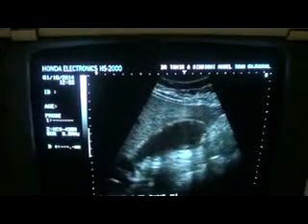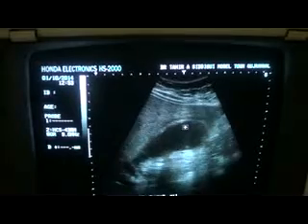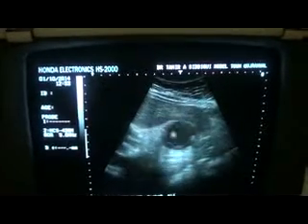This shows the anterior and posterior wall of the gallbladder. These are all crystallized.